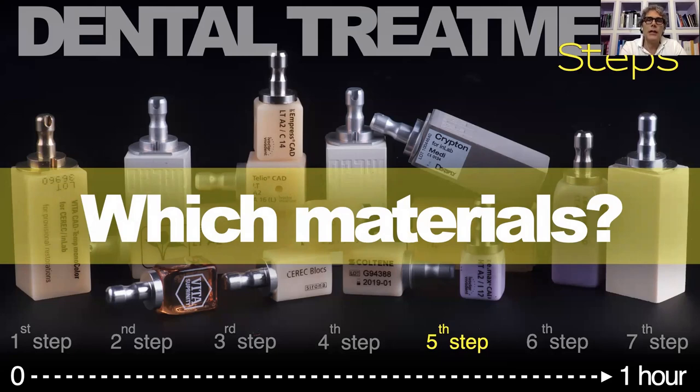After the project, one of the most important questions is: and now, which materials do I have to use to obtain the best result in this case? In this regard, I firmly believe that the modern dentist who decided to embark on the digital road should know very, very well the physical and chemical features of the CAD/CAM materials that are on the dentistry market. Because that is fundamental, because these features are the direct expression of the final result from an aesthetic point of view, but also from a biomechanical point of view.